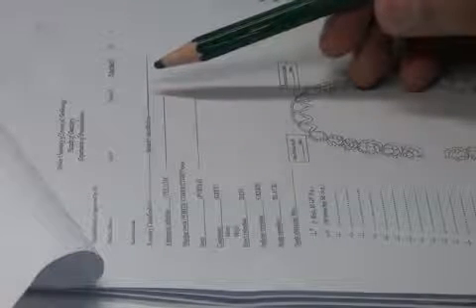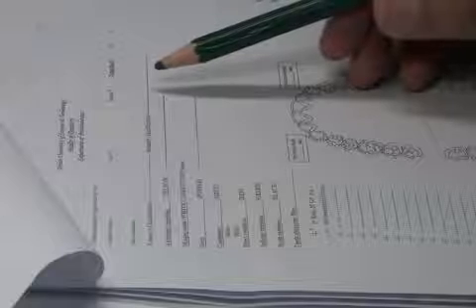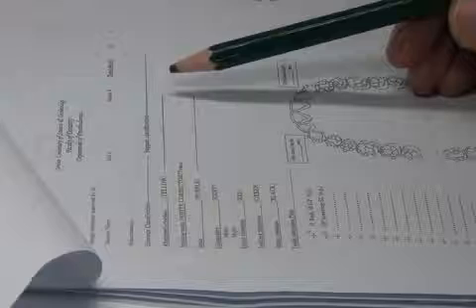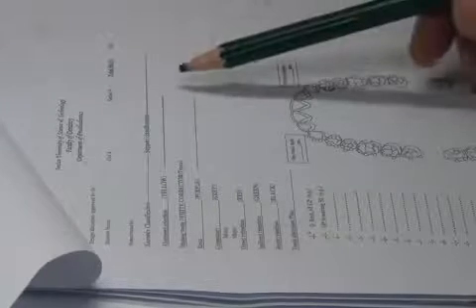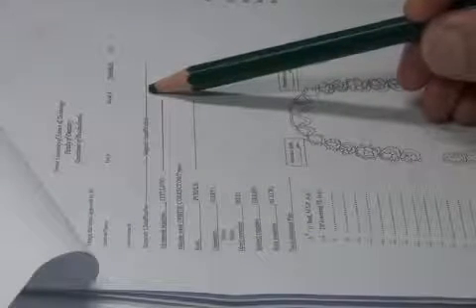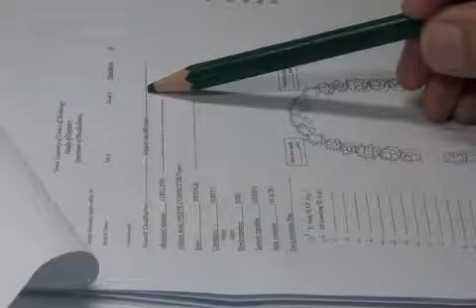For the support, classification is very important for you to understand, okay? It includes taking into account the Kennedy classification as well as the length of the bounded saddles if they are present, okay? Because with long bounded saddles, there will be a shift in the support. Once you have a shift in the support, whenever we write down, for example, tooth-tissue support, that means we are looking for stress-releasing designs for components, okay? We're looking for stress-releasing methods.